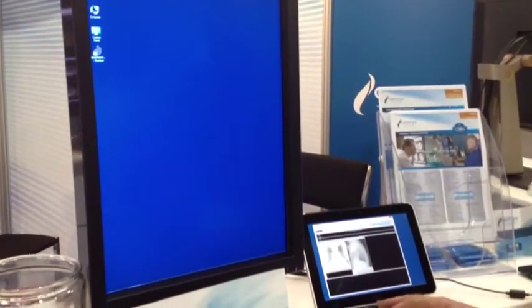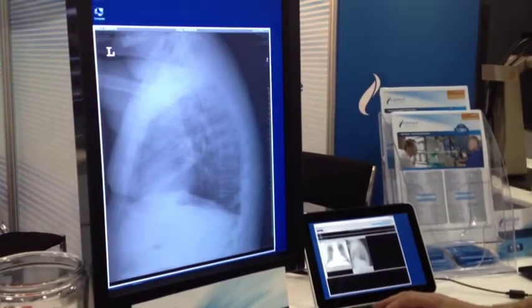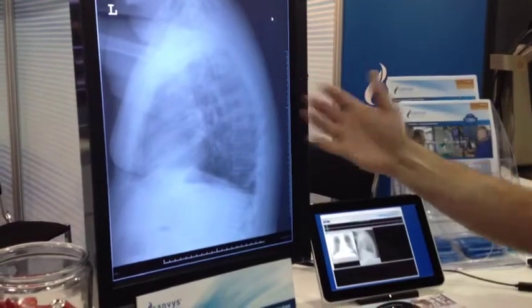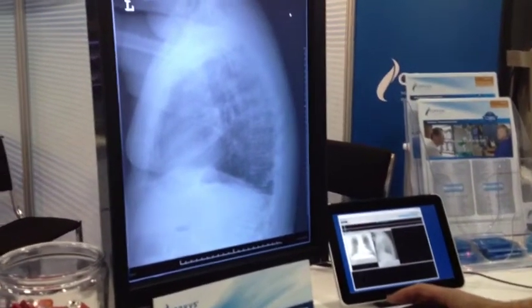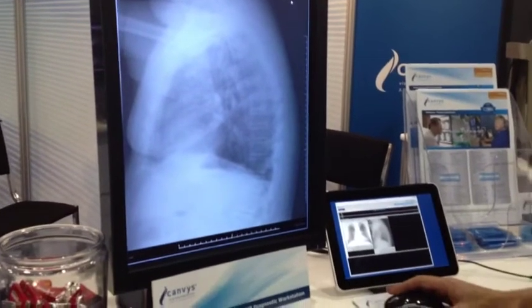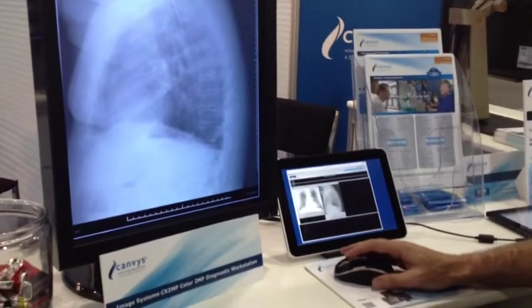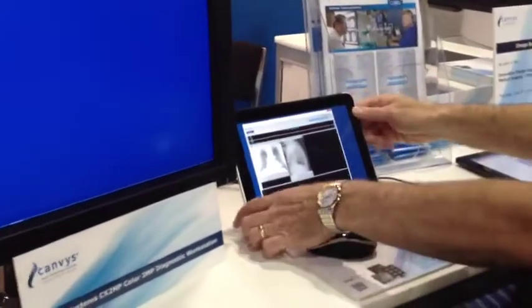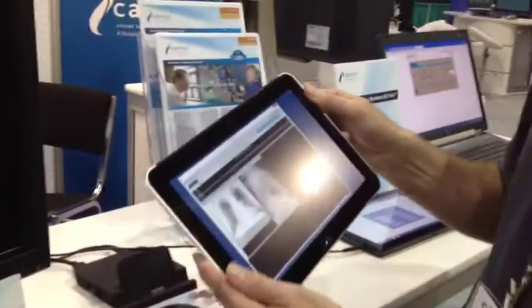So I can simply pull up the image on this monitor and really see the subtle details of that image and make a good, accurate diagnosis. And then when I'm done, I simply pull the ElitePad 900 out of the docking station.